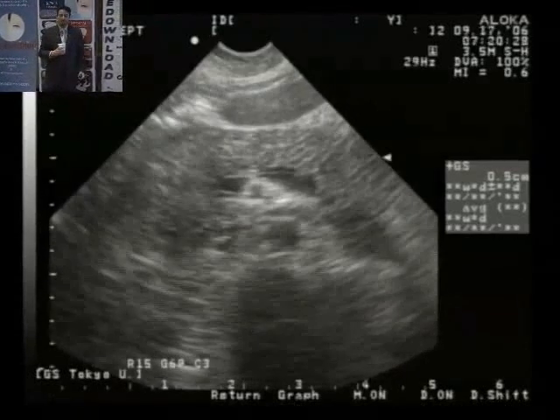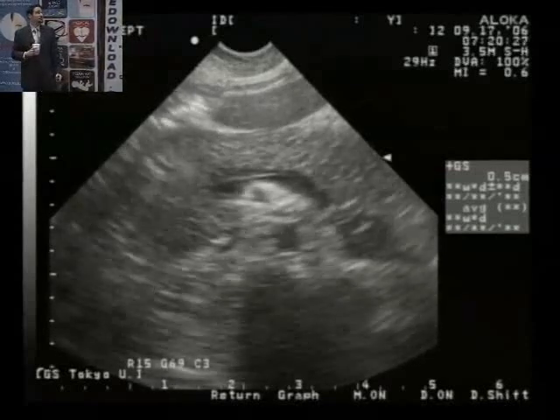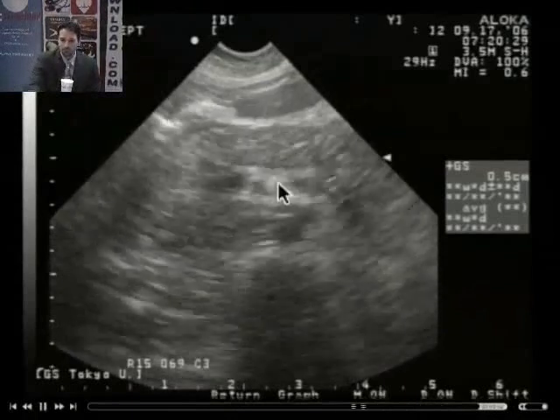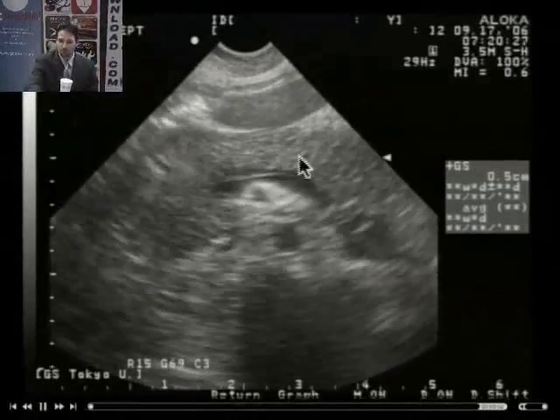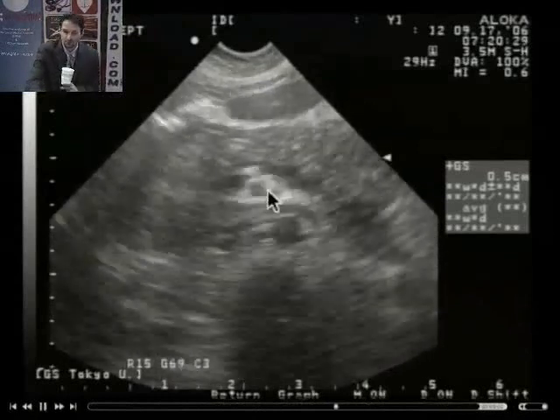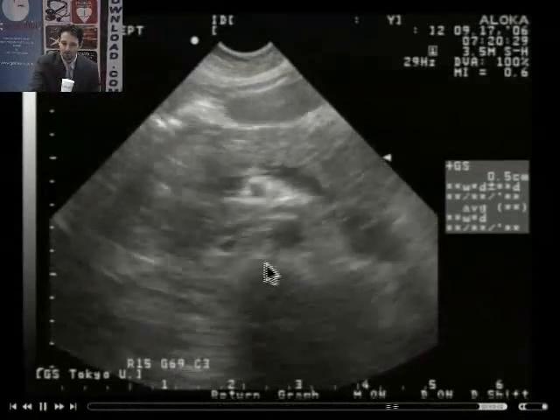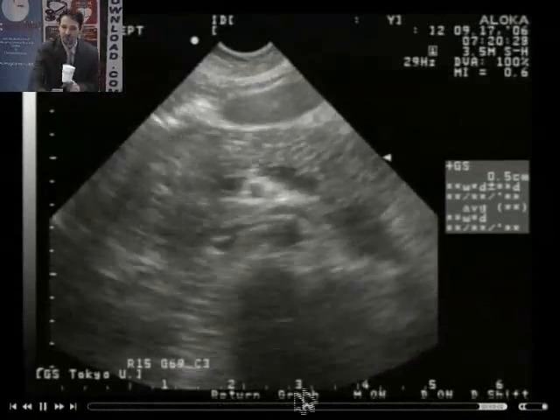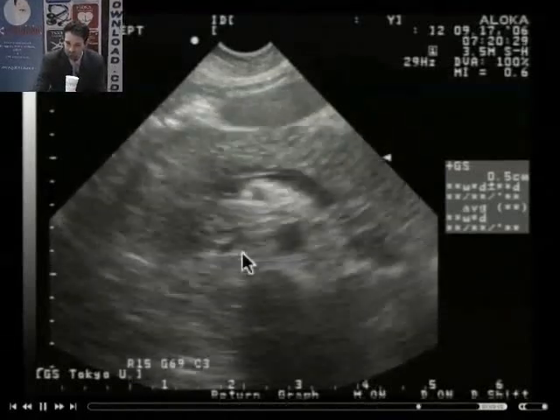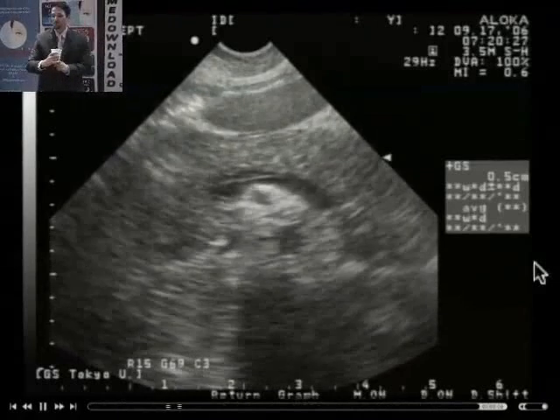All right. Again, this is another clip of the epigastric aorta. You see the pancreas in the foreground. Again, below that, the splenic vein. See the SMA right here. Aorta. And vertebral body with shadow. The IVC is almost invisible here because it's so collapsed. It's right here. So this is how the aorta looks in the epigastrium.